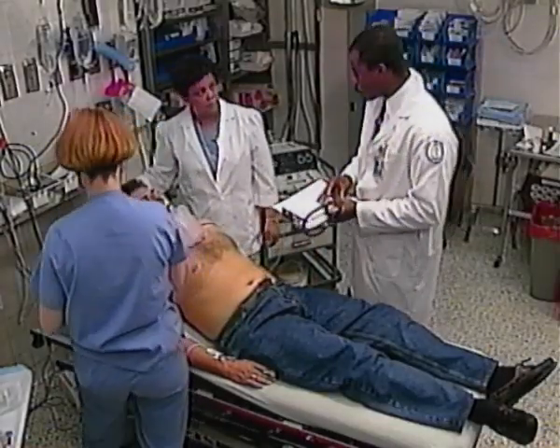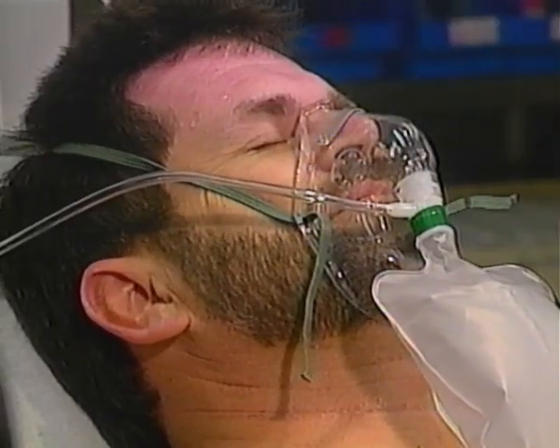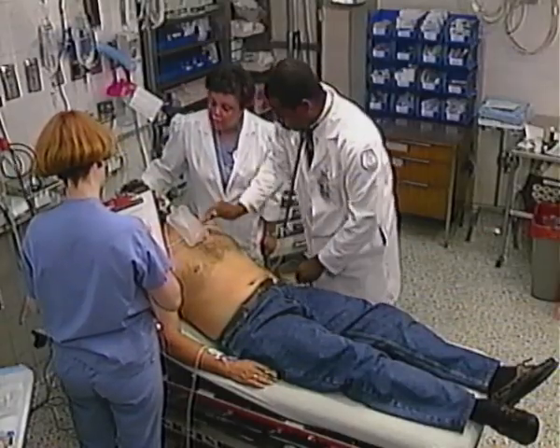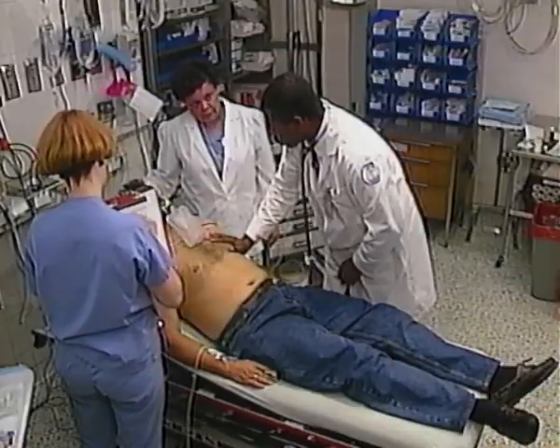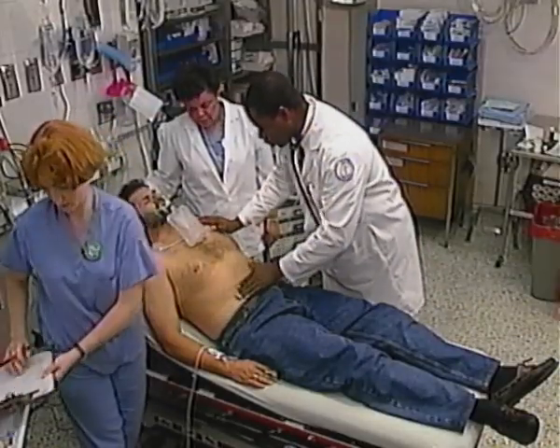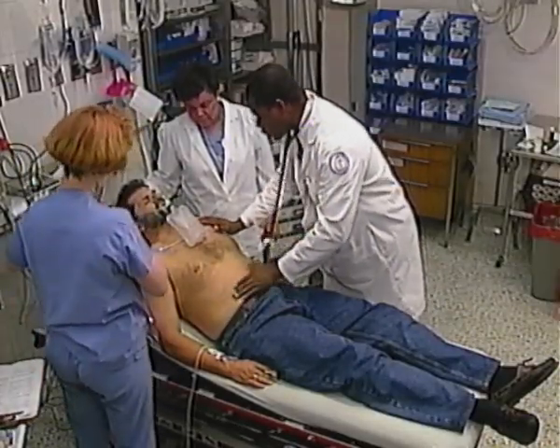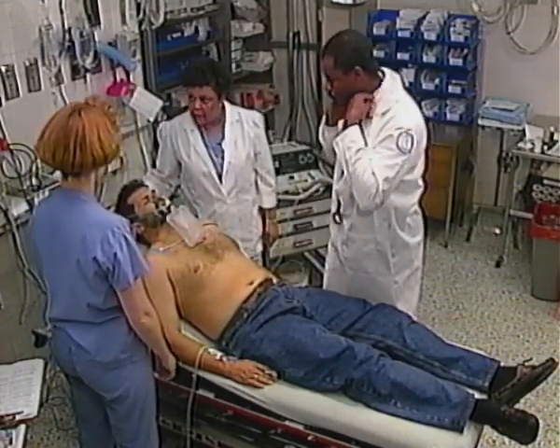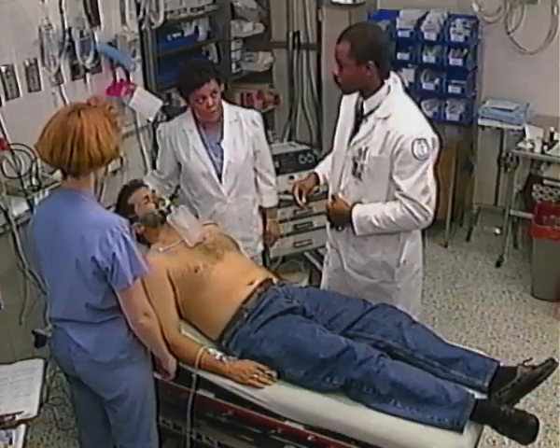Hi, Terry. What's his current status? This is Mr. Jackson. He's a 45-year-old gentleman who presents to the emergency room complaining of difficulty breathing, chest pressure, and weakness. Right now he's in V-tach, and his blood pressure is 74/50 with a pulse of 190. What's his current oxygen saturation? His current oxygen saturation is 94%, and that's on 15 liters via partial rebreather mask.